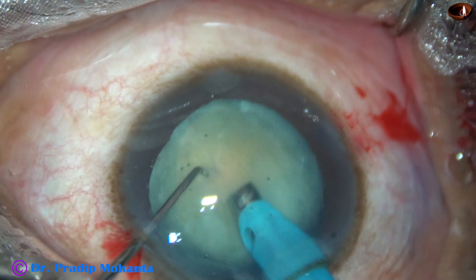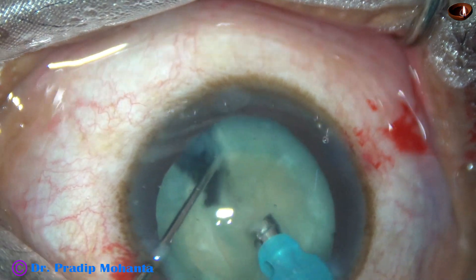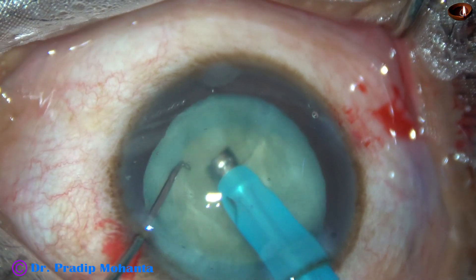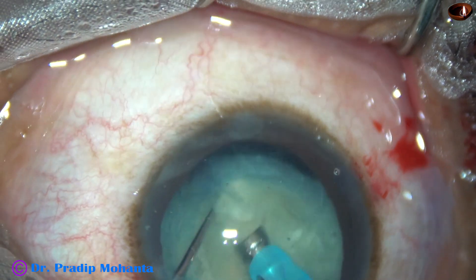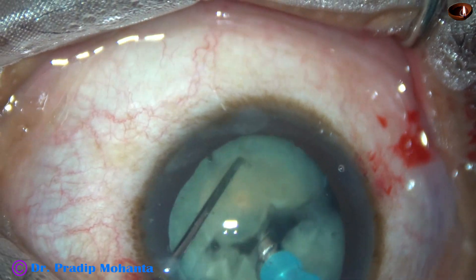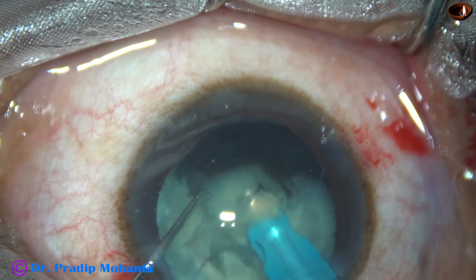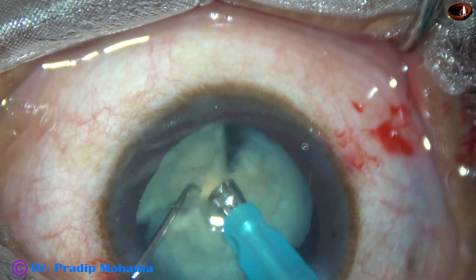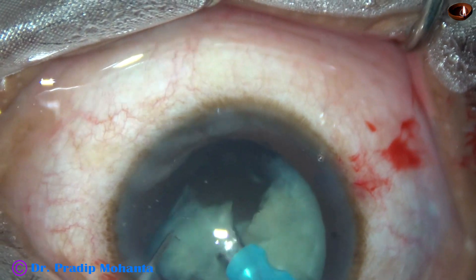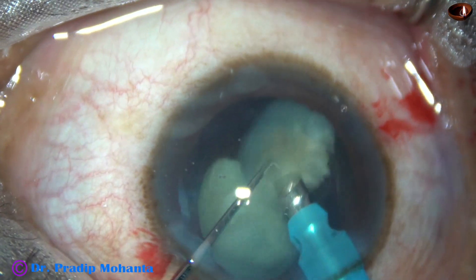Now watch the indirect chop. The tip is buried into the substance of the nucleus and it is chopped. If we can divide the nucleus like this, we don't have to do a trench, spend about 2–3 minutes, and use a lot of ultrasonic energy. We just hold the nucleus and chop, then emulsify the pieces using very minimal ultrasonic energy. Deliver the ultrasonic energy at the iris level or at the anterior part of the capsular bag so that the corneal endothelium is nicely protected.